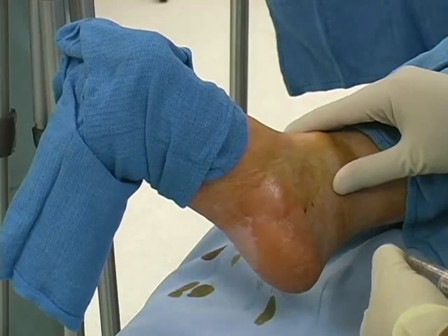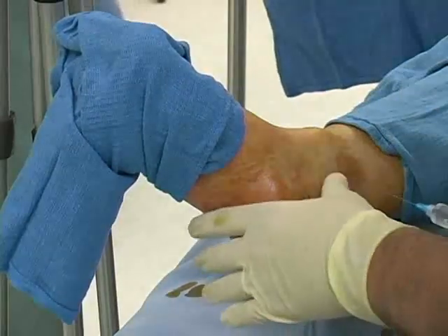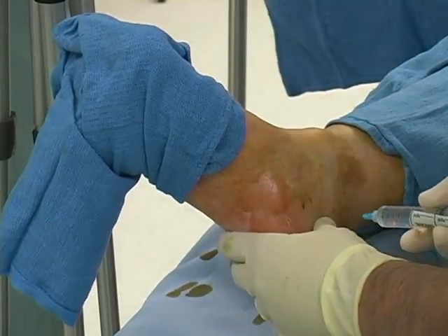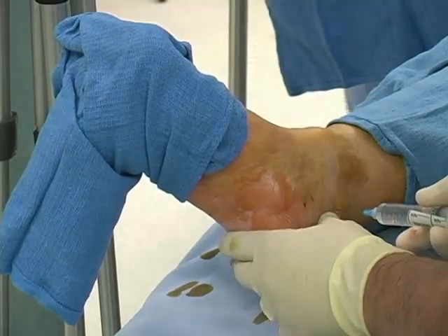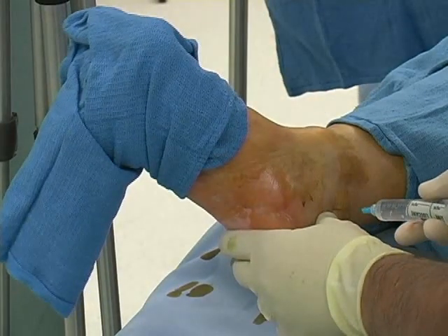Facing the patient's medial ankle, identify the malleolus and the Achilles tendon. Palpate the pulse of the posterior tibial artery in this space. The posterior tibial nerve is posterior to the artery.